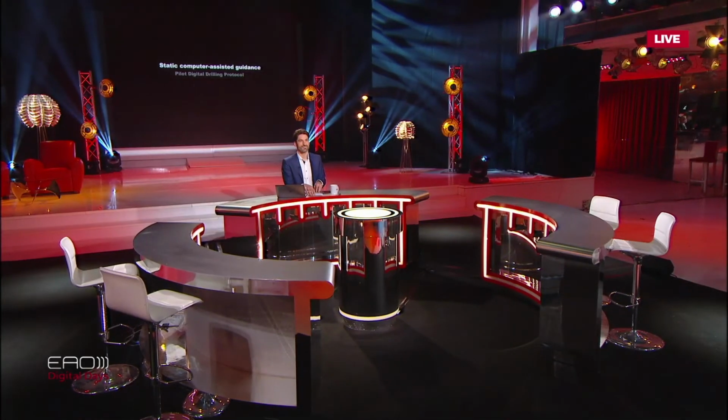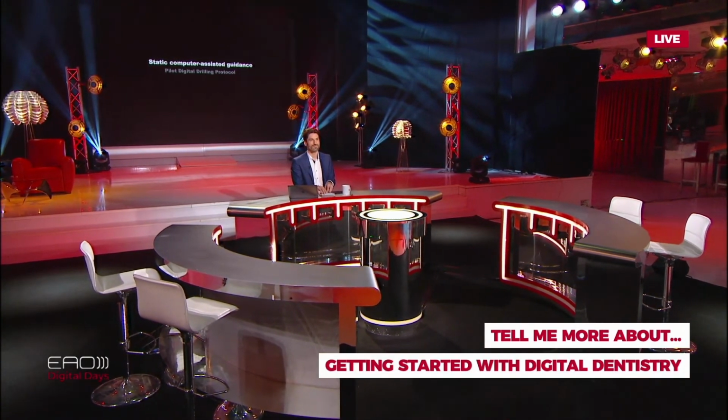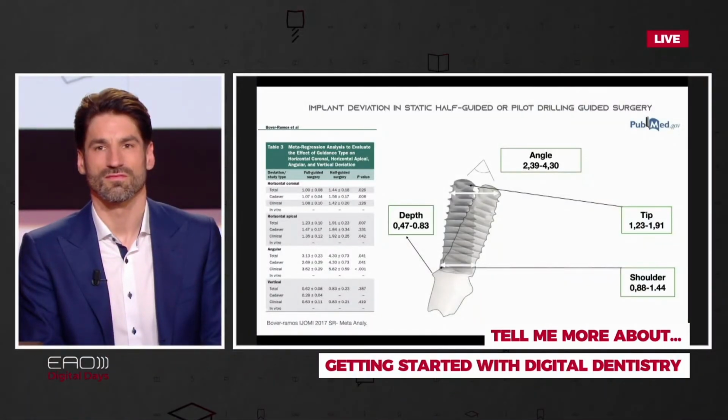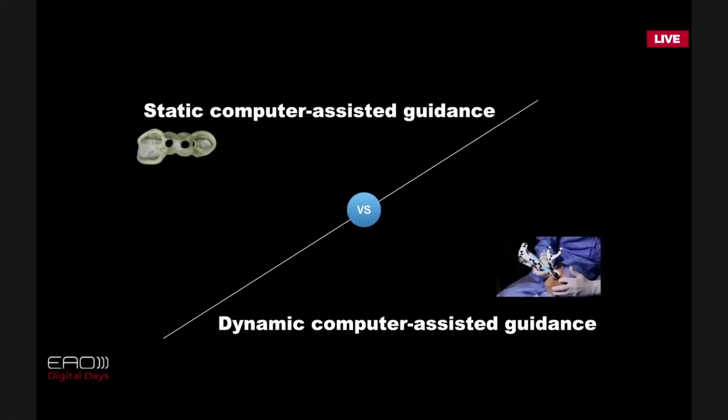So the same error exists not only in fully guided systems, but also in partial, the so-called pilot drilling, meaning that if you only have a guide to pinpoint where is the best prosthodontic position, you still have an error. The latest systematic reviews from 2017 clearly show there's also still an error, more than the fully guided surgery, it's obvious, but you still have an error. So either if you go pilot drilling or fully guided, you have an error.